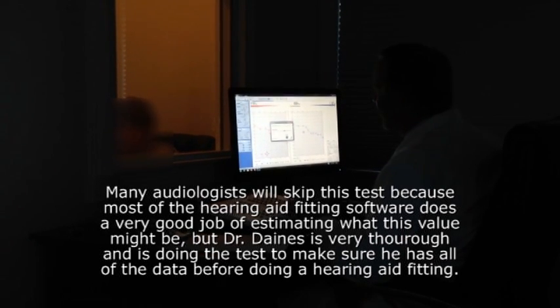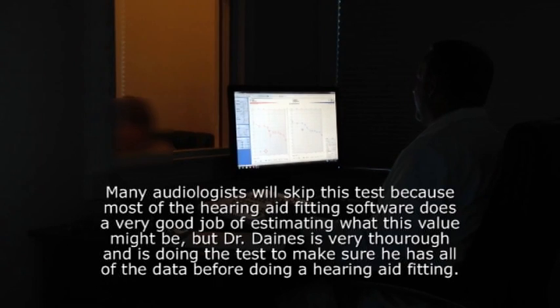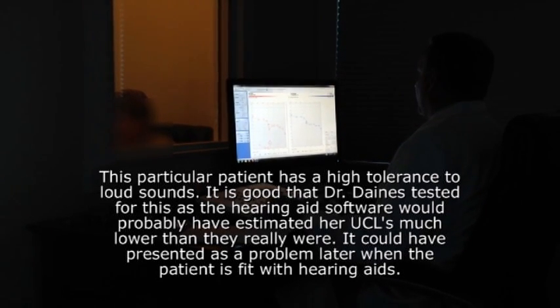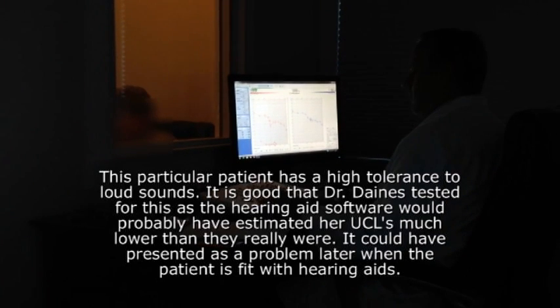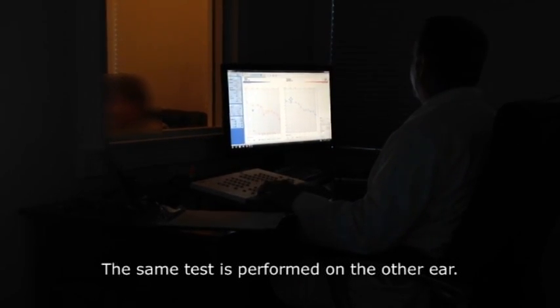You reached the limit of my machine there. Okay, we'll keep going then. You reach the limit of the machine again. Okay, we'll do the same thing but on the left side. Okay, that's it for that. We're almost done. I'll be right in to switch your headphones around.